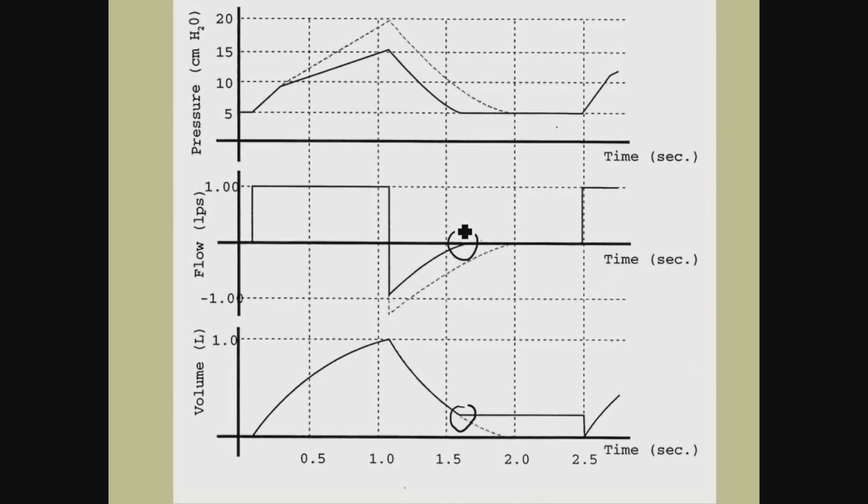But you're right, with air trapping, you might not see the full complement of volume returning that you put in. So you would look to see if it's at least coming back to baseline, to see if you had any auto PEEP. Correct. And in this case, there's no auto PEEP, it's just a leak in the system someplace.